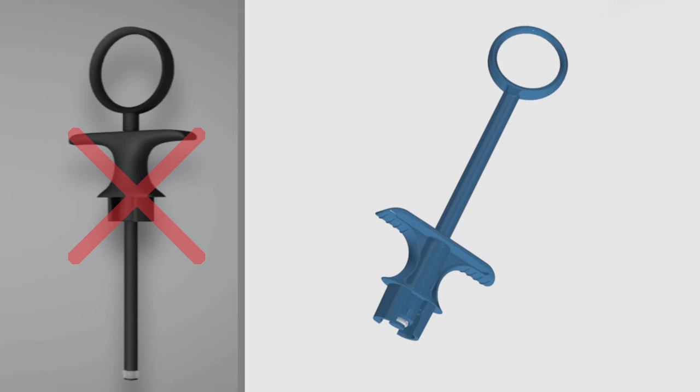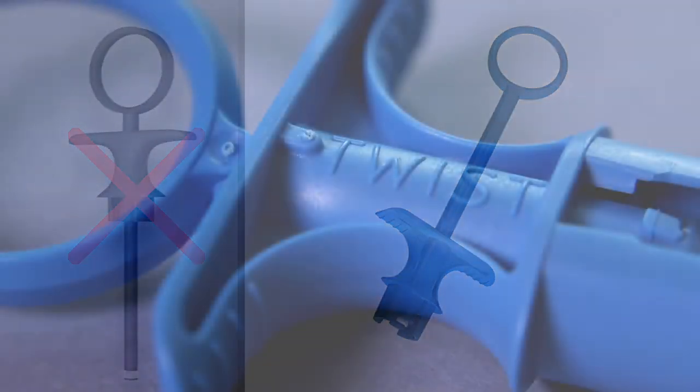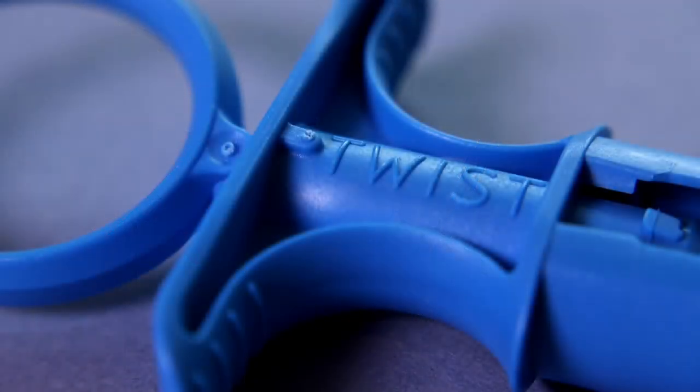ULTRA SAFETY PLUS TWIST should now be used with a blue TWIST autoclavable handle, which has a TWIST engraving on the finger grip.